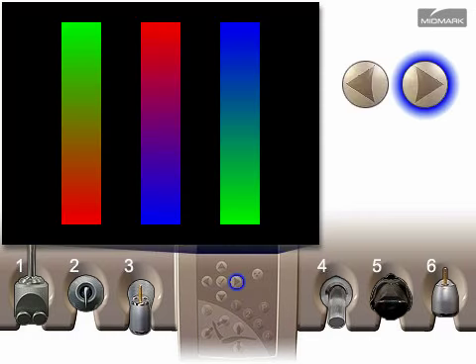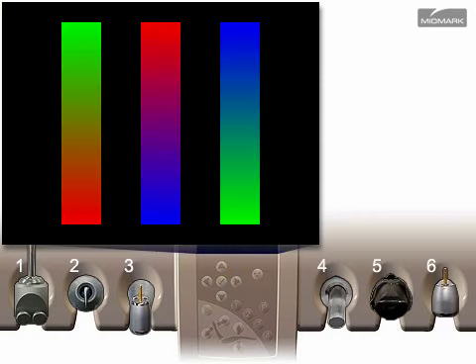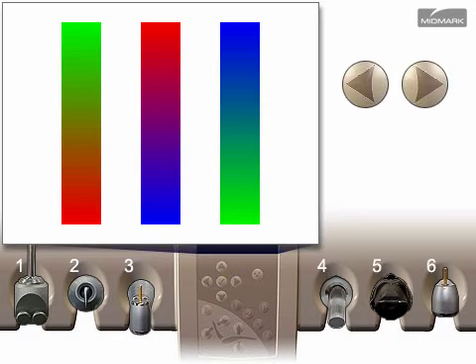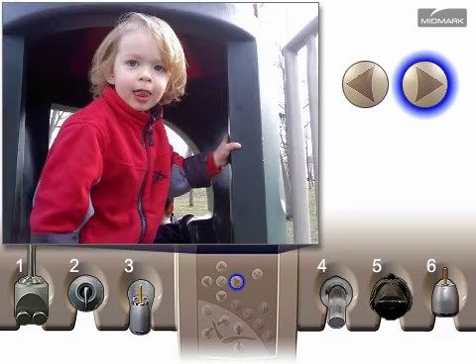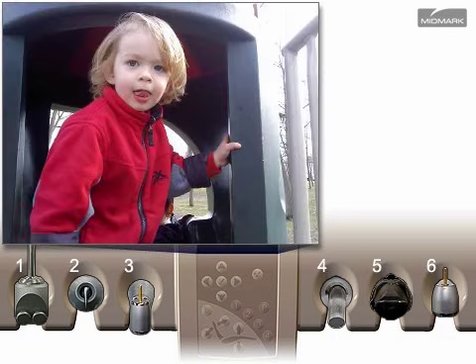Press the right or left arrows to change the screen. There are three color-rich screens that are used by the manufacturer to diagnose problems on returned goods. These are not intended for field diagnostics.